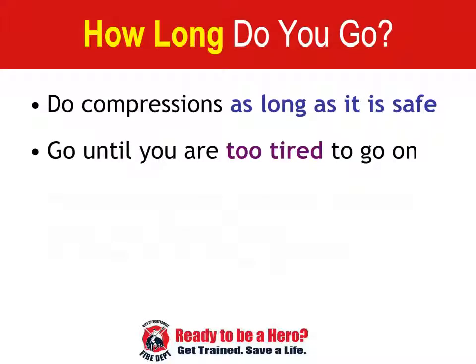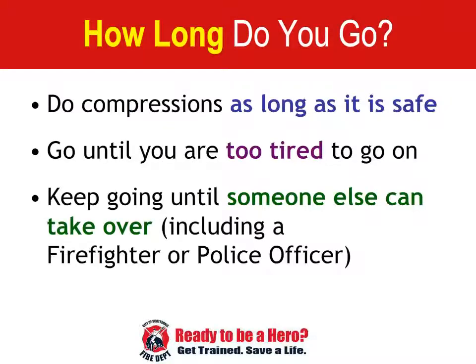If you are too tired to go on, you can stop. Compressions are physical, so it can wear you out. However, in most cases, you would only have to administer CPR for about 5 minutes. We hope you will keep going until the emergency responders arrive. And if you can share the responsibility of compressions, that's great. As we fatigue, we don't push as deep or as fast as we should. Switching off doing compressions can help you rest and come back strong at your turn.